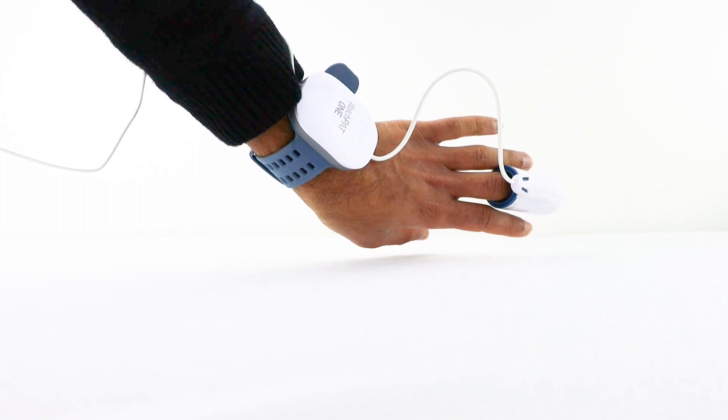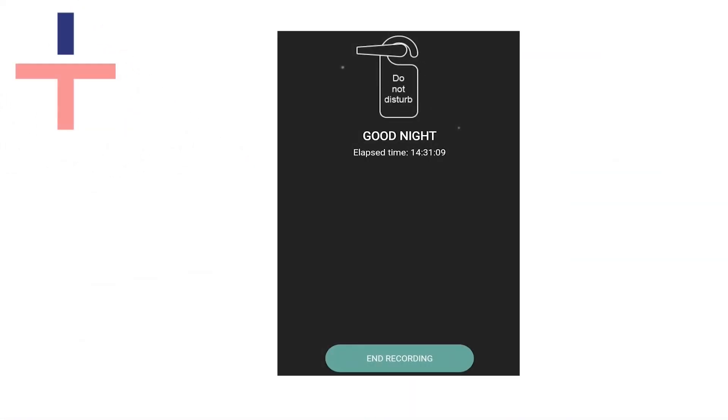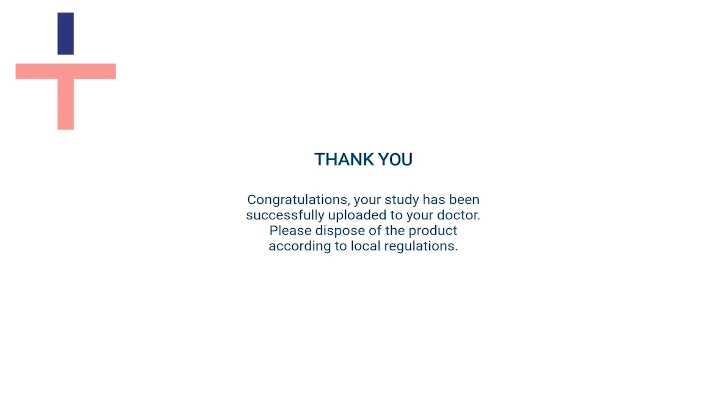If you need to get up throughout the night, do not remove your test equipment. When you wake up the following morning, press end recording on your WatchPad app. Your app should display a thank you message to indicate that the test is now complete.